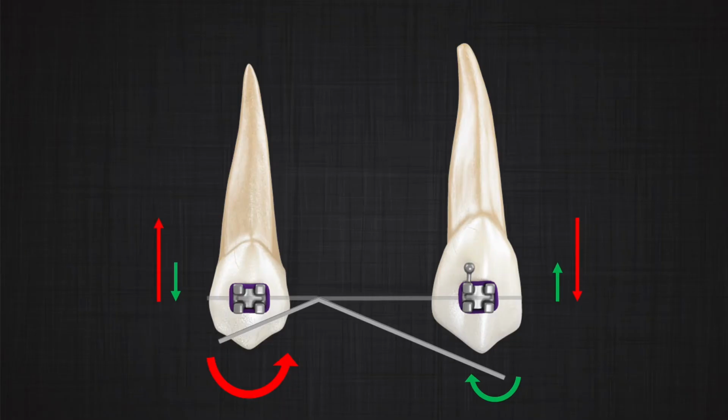But there is one problem here. This system doesn't seem to be in equilibrium. The forces cancel each other, but the magnitudes of the moments in the system are not equal. Therefore, the system shouldn't be in equilibrium. Well, actually it is. If you look precisely, you will notice that the forces that act on the canine and the premolar, applied on two sides of the wire, are actually producing a couple.